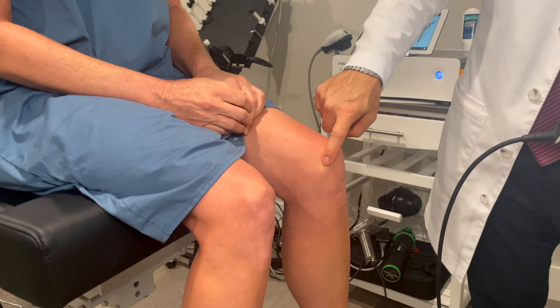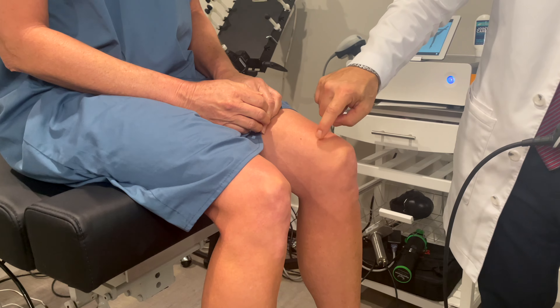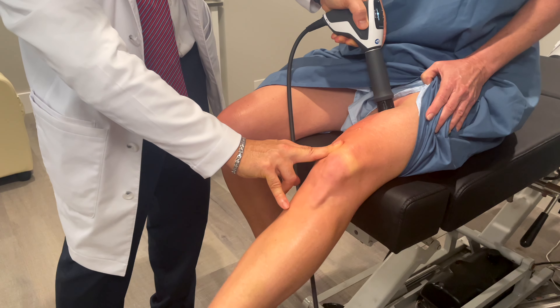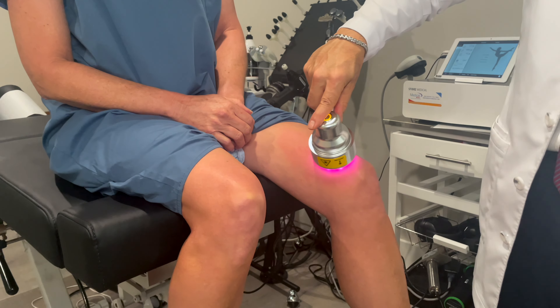So we're going to go ahead and do a treatment to clear out that adhesive scar tissue. We discovered that the adhesions are coming from right here, so we're going to clear this area out. The tissues will saturate with the laser light.